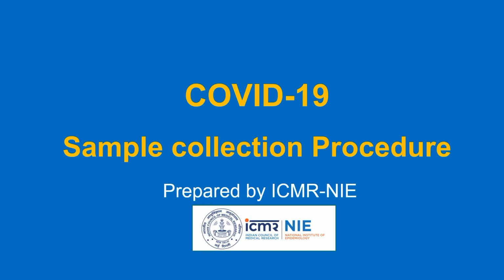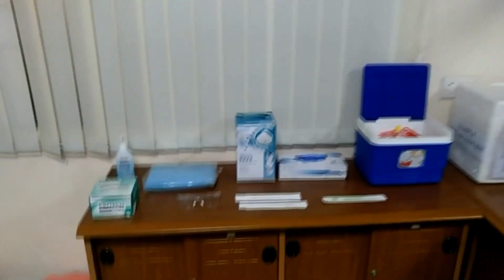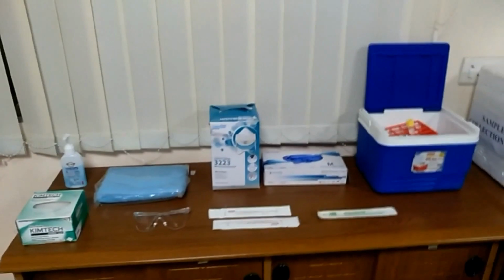The following is a presentation on nasal and throat swab collection for testing for respiratory viruses such as SARS coronavirus, influenza viruses, etc. Ensure that you have all the required materials, including PPE, before sample collection.